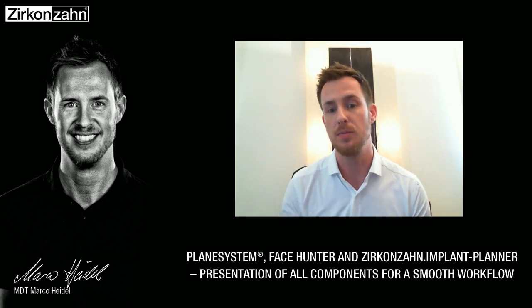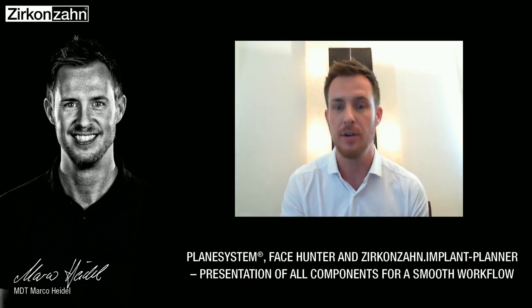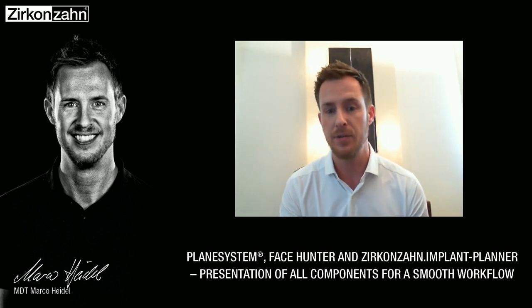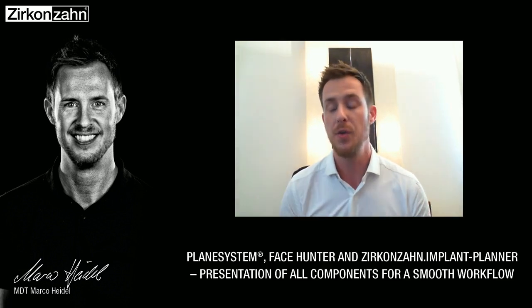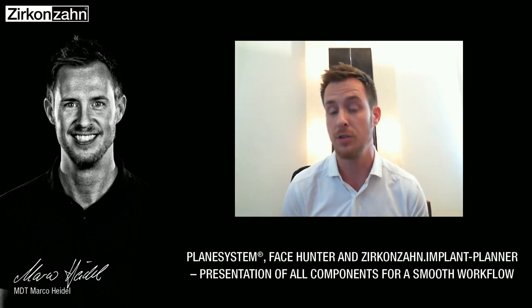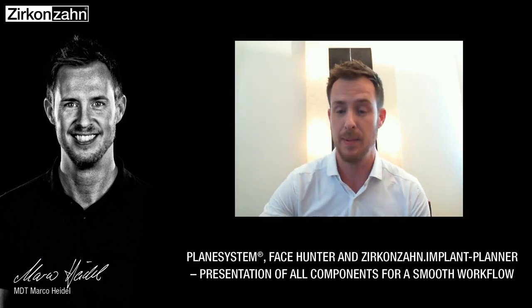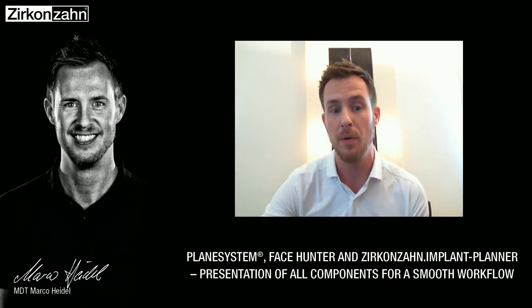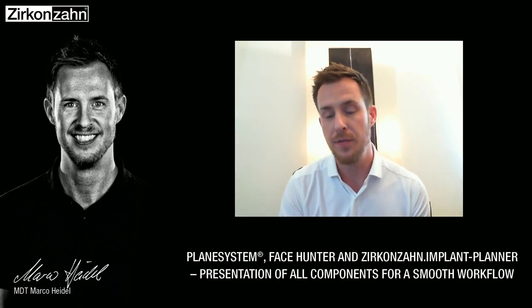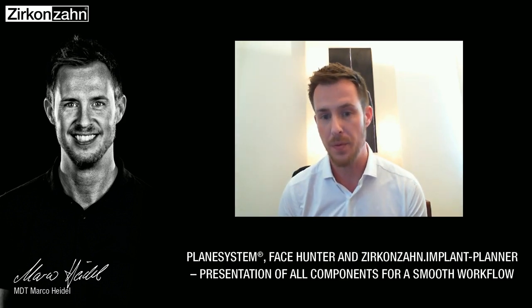We made a small over-texture onto the surface, and after sintering you get this effect. You get a really, really thin veneer. It's only 0.2 millimeters thin. We have a special strategy as well to mill the borders very thin. And then it's time just to stain and glaze the surface, and this is the result in the patient's mouth.